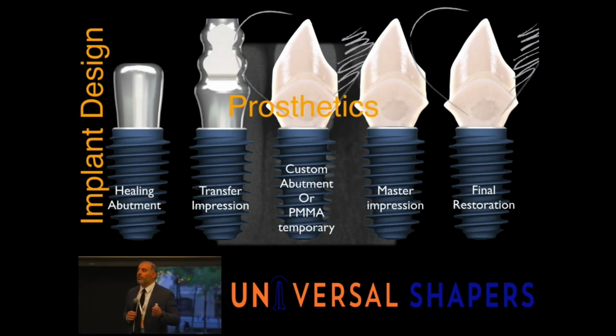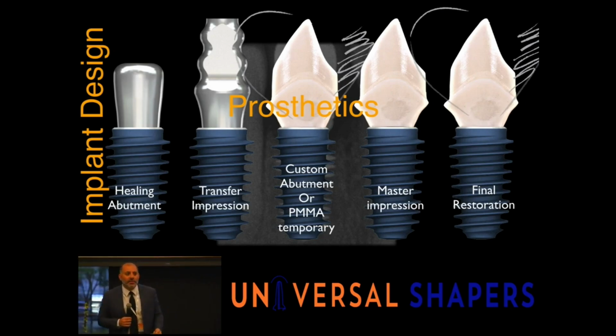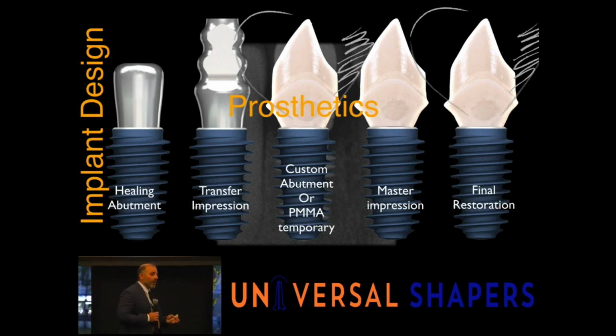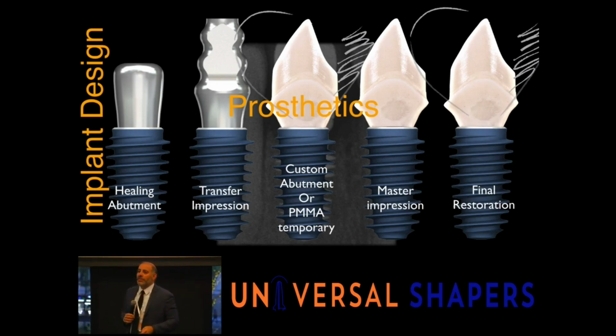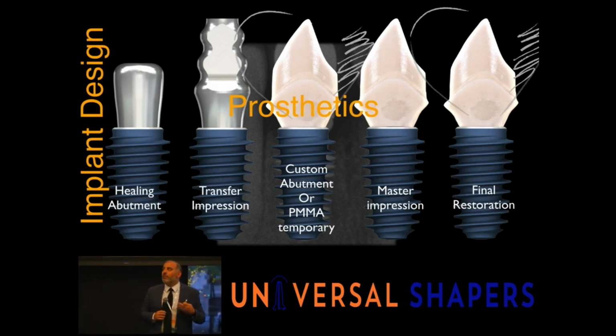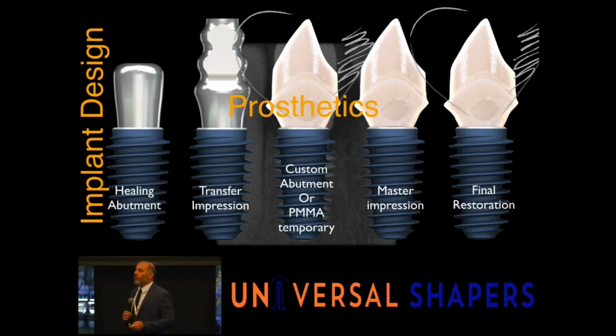When you start to place your healing abutment, your transfer coping should be of the same type of design so you can capture appropriately. And then your final abutments or your temporary abutments should all be of the same design, whether you're doing screw retained or cement retained. I prefer screw retained myself whenever possible, but we want to try to preserve that S-line type shape so that we can have more soft tissue in that area.